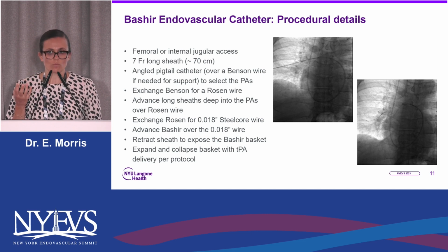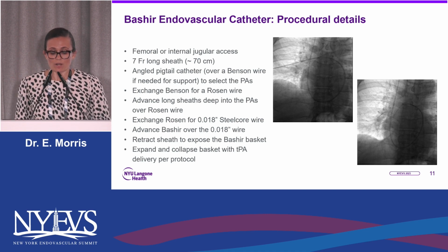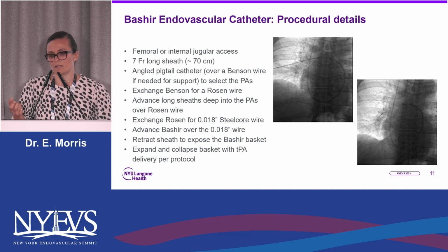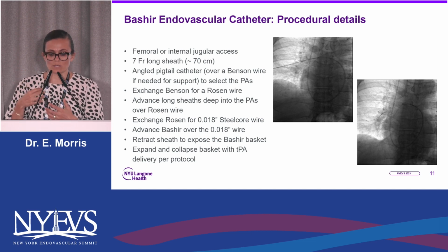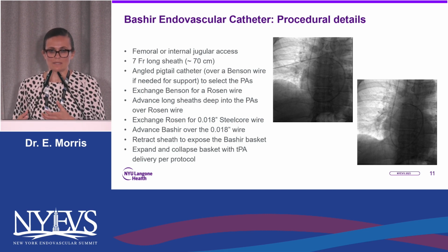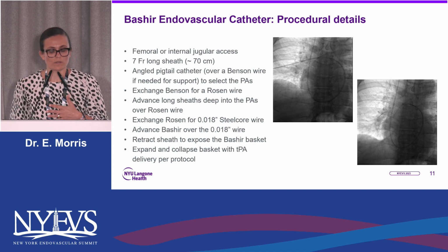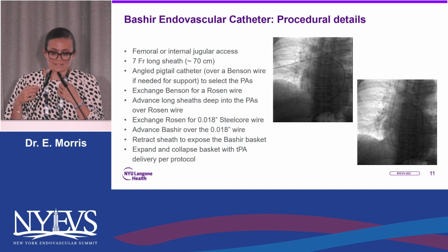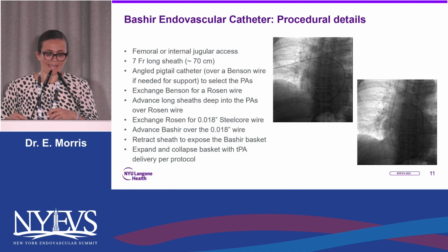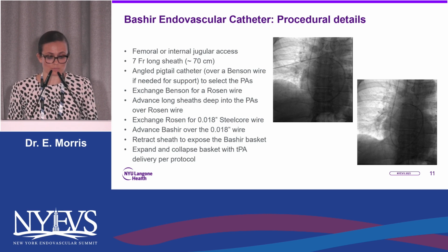So you don't have to worry so much about 24 hours of lysis catheters hanging out of the patient's neck or groin. But also, if you recall from the previous slides, you have that deployment mechanism still attached to the catheter that is going inside of the patient's body. So you've got to do something with this deployment mechanism. When you go in from the neck, it's a bit cumbersome to secure it to the patient's chest. If you go in through bilateral groin access, it's nice just to have them secured down the patient's leg, and then it doesn't tend to move around, and it's as comfortable for the patient as is possible for the 5-hour dwell time.